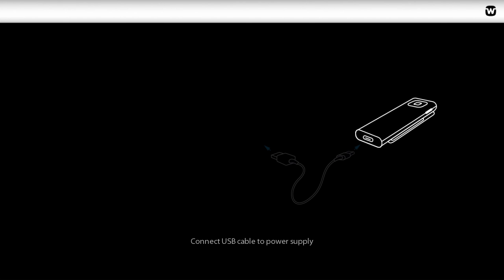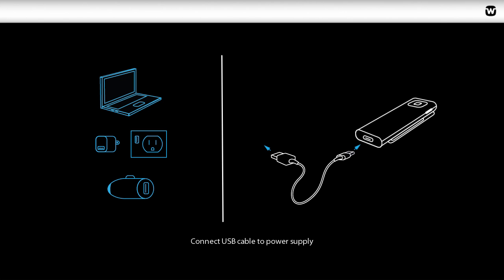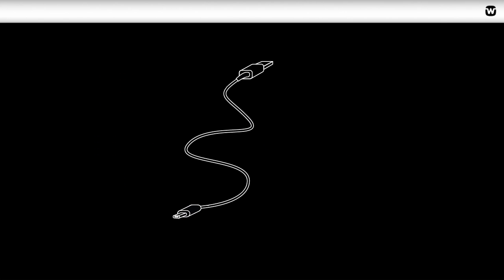To charge the Remote Mic, simply connect the supplied USB cable from the device to any USB power supply, such as a wall socket, computer, or car charger. Use the supplied 20 cm USB cable or any other standard USB cable with a micro USB connector.